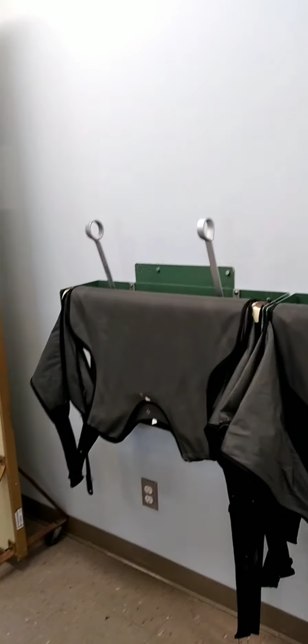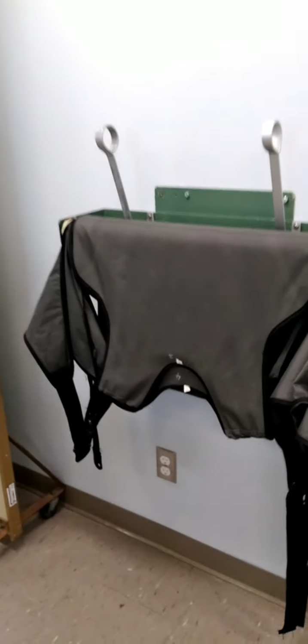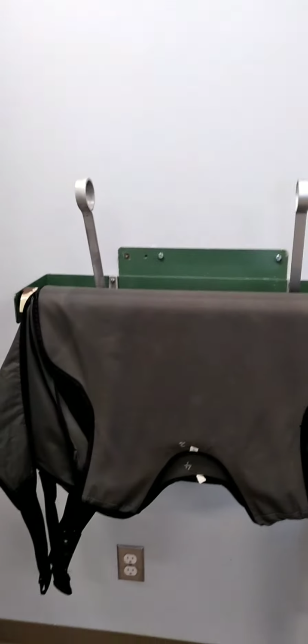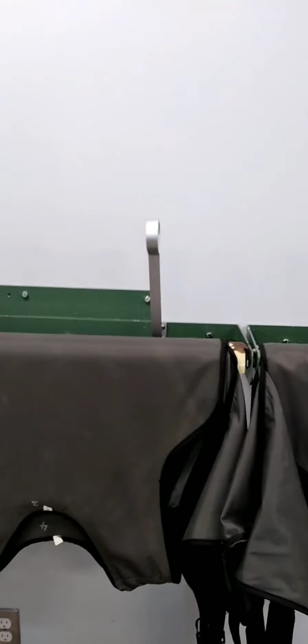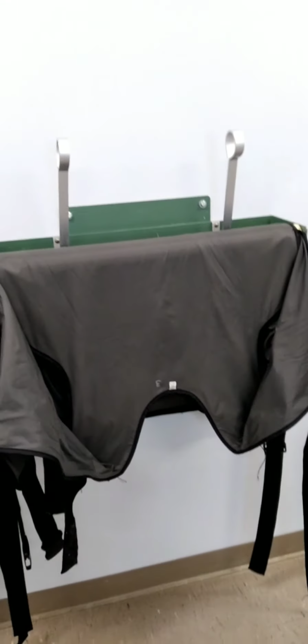So here we have our x-ray gowns hanging up nicely neat and flat so the lead inside them doesn't crease. We have 4 of them, different sizes. In a different video, I'll show you how to put them on. They always have to hang like this, with the flat panel going behind the rolled bar and with the front portion of your chest and the shoulder pieces hanging in front, just like this, to keep them nice and flat.